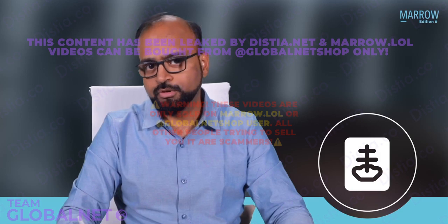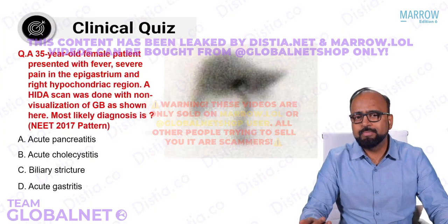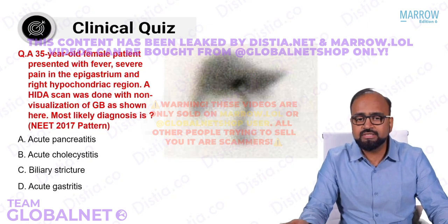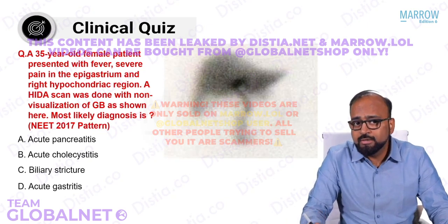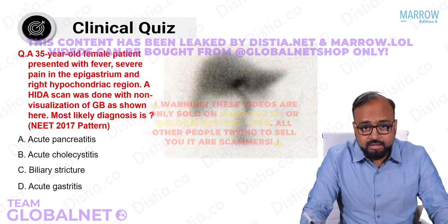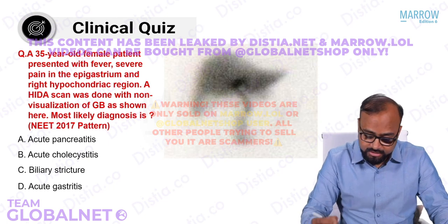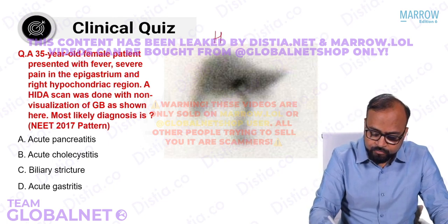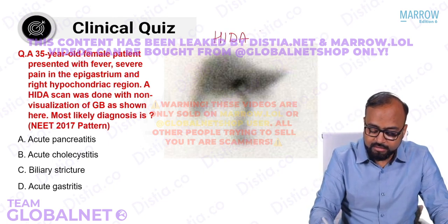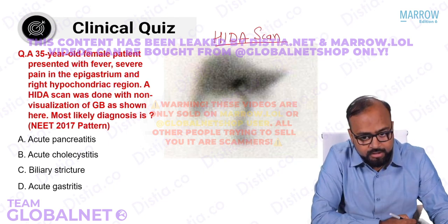Before we go to this particular question, look at this blurred image. Are such blurred, hazy images still used for making a diagnosis? Well, honestly, clinically, they are not used. But as far as your exams are concerned, they are important because this is an image of a HIDA scan. And a HIDA scan has certain specific applications in hepatobiliary imaging.